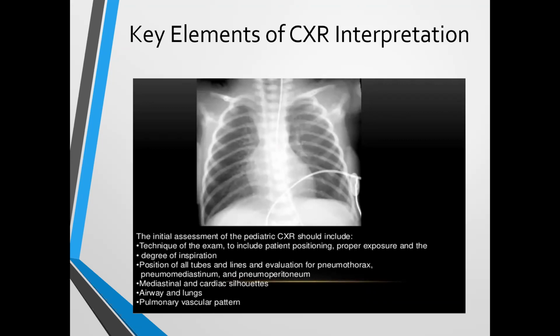And again, obviously your neonatal patients are not going to be able to follow commands. So when you ask them to take a deep breath, chances are that's not necessarily going to happen. But certainly when you get into your middle and older pediatric patients, they should be able to do that just fine.